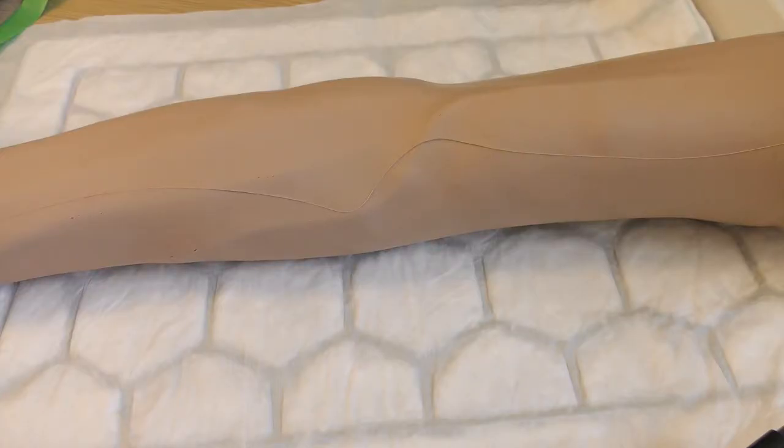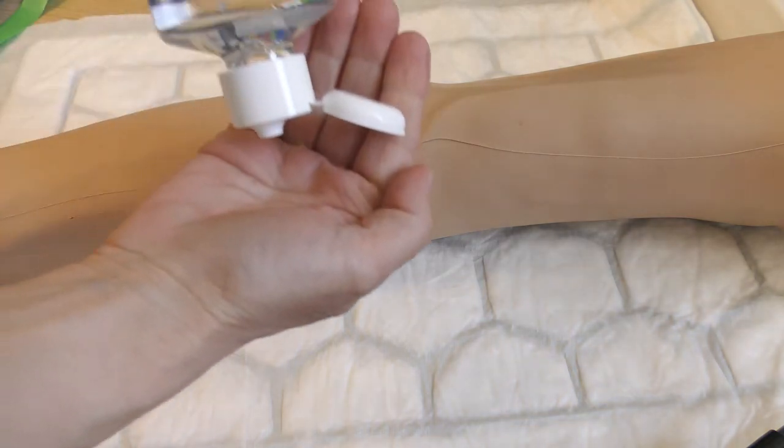Confirm the patient's identity, explain the procedure and gain consent. Decontaminate hands with alcohol gel.